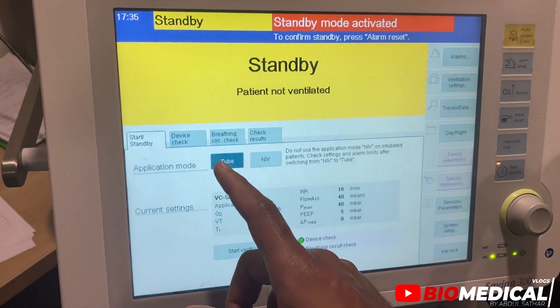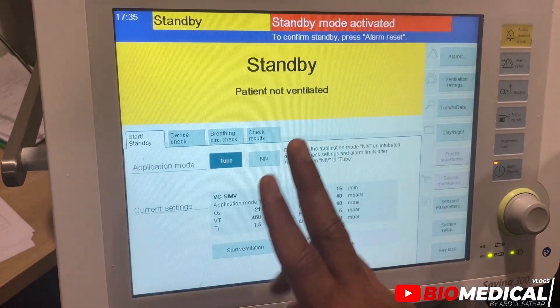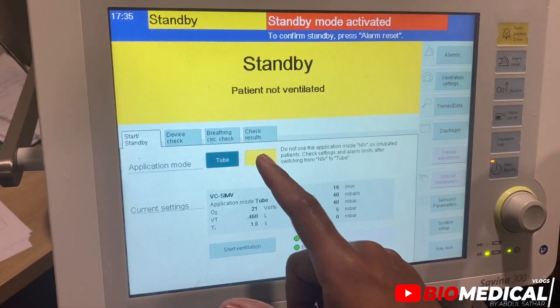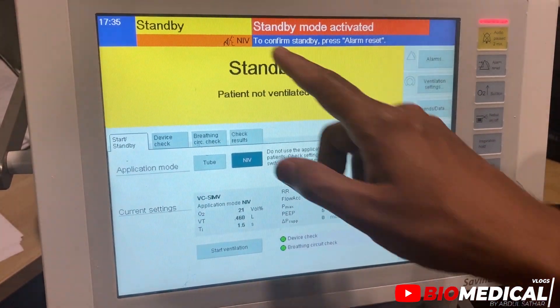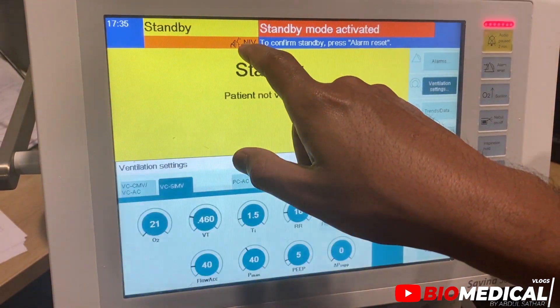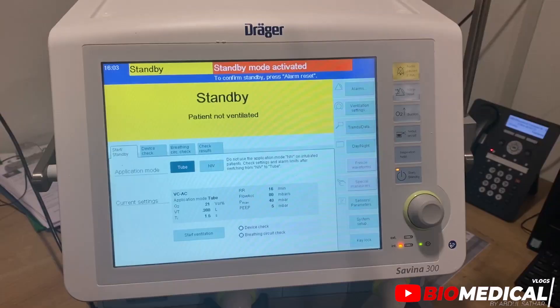We have to set the application mode before using: Tubes for invasive ventilation, and NIV for non-invasive ventilation.